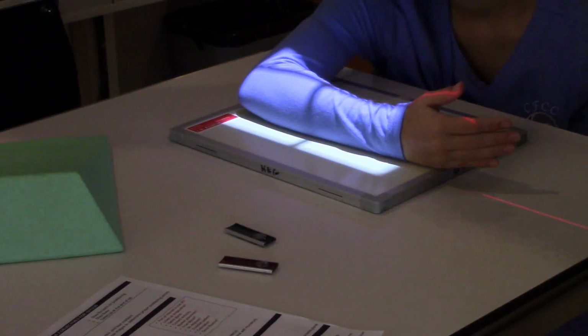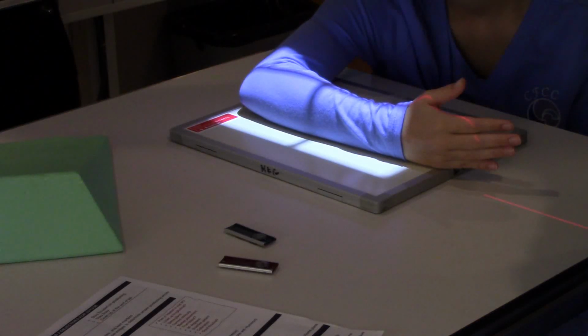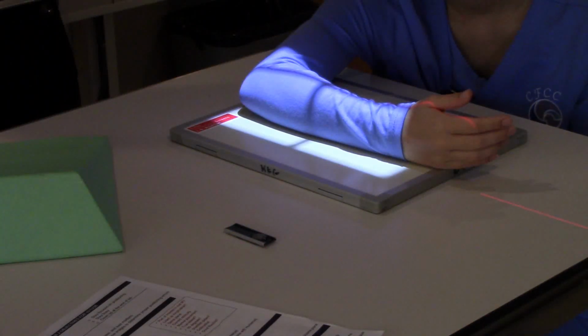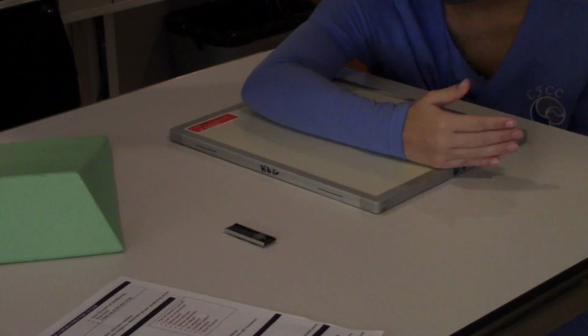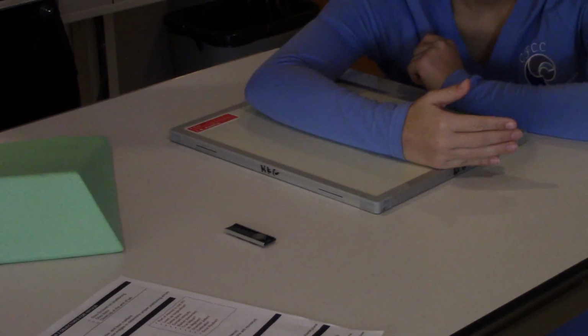Once again, you can open up your collimator a little bit lengthwise. We need to include the wrist and the elbow joint. Make sure they're in the light field and on the image receptor. And then we're going to ask Ms. Abby to do something additional for us. See how her humerus is at an angle to the image receptor? That's going to mess up our joint space. You see what I'm talking about? Okay, so how can we get her arm more on a level with the table? Well, hang on, let me back up just a little bit. All right, bring that table on up.